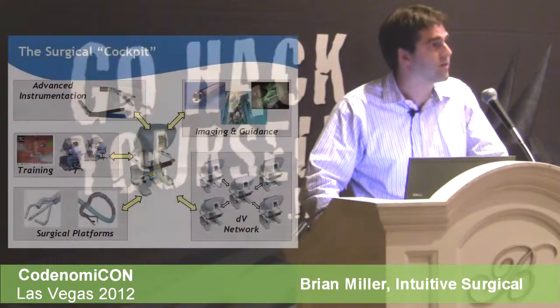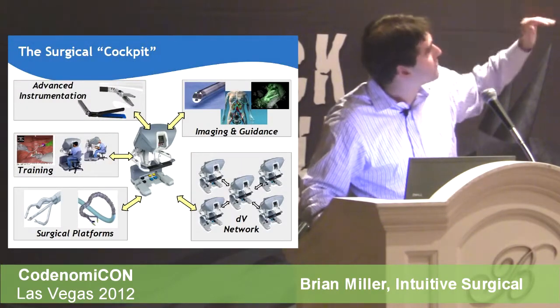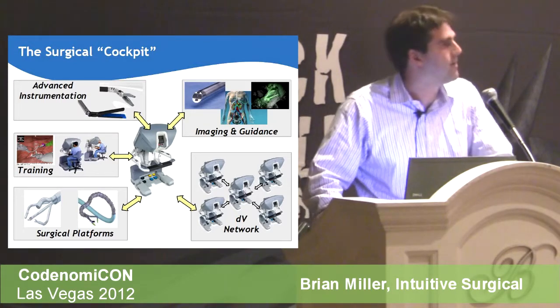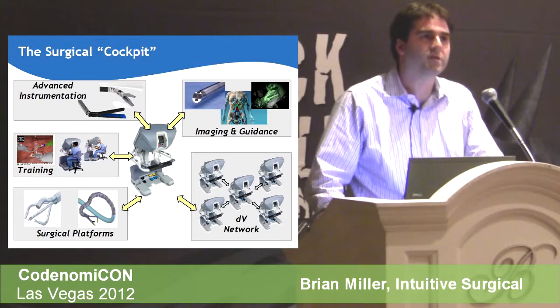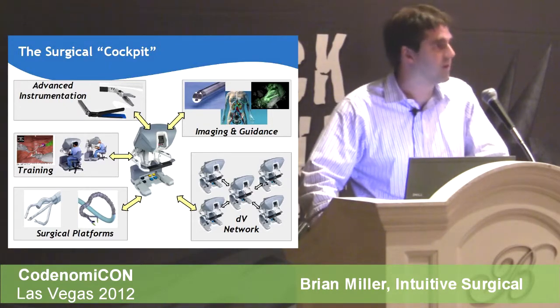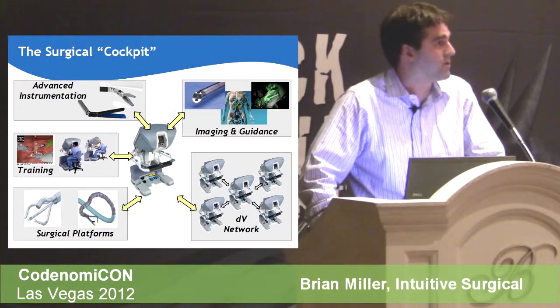And so one of the things that we've been looking at is as we test our system, when we look at the remote applications, these are in order of importance what we're looking at when we test. A lot of the remote capabilities are auxiliary functions. They're not required, unlike the telesurgery where the link is in critical path. Some of the servicing and mentoring aspects, the network's not in critical path, so they're auxiliary type of capabilities.